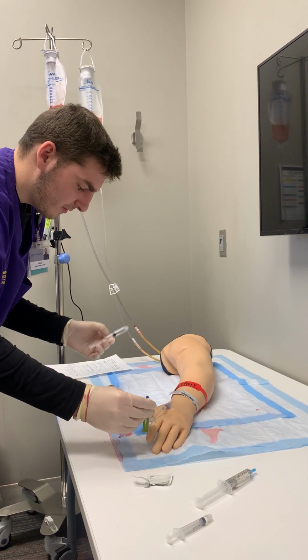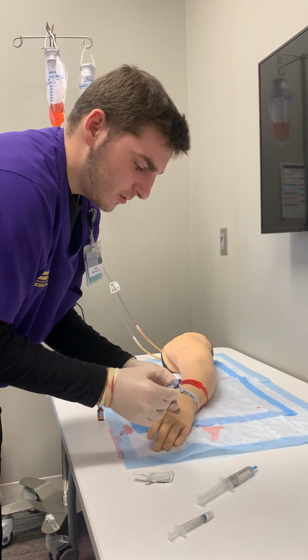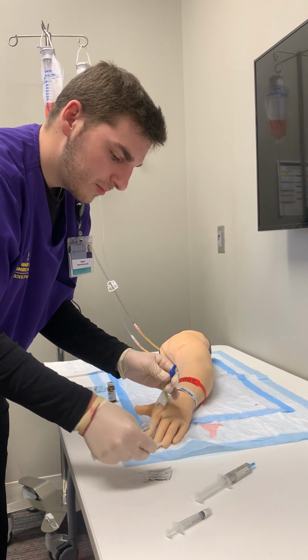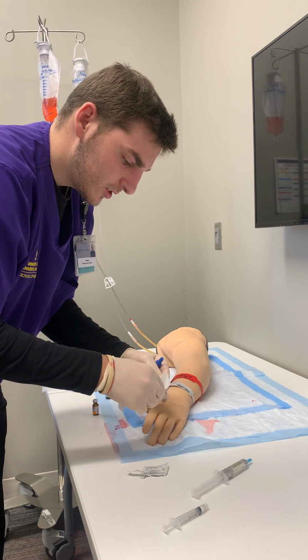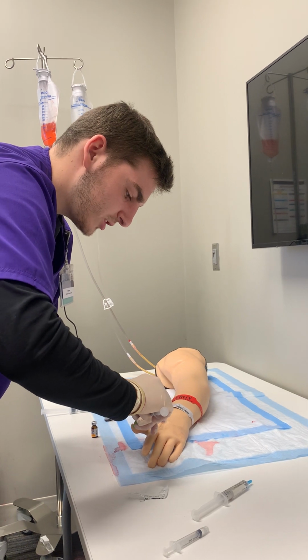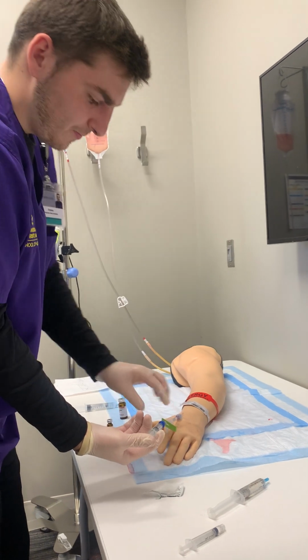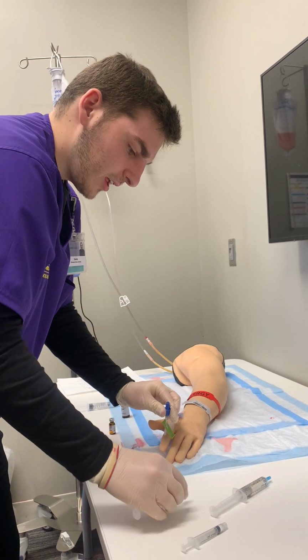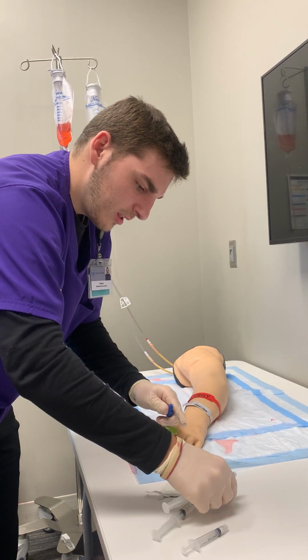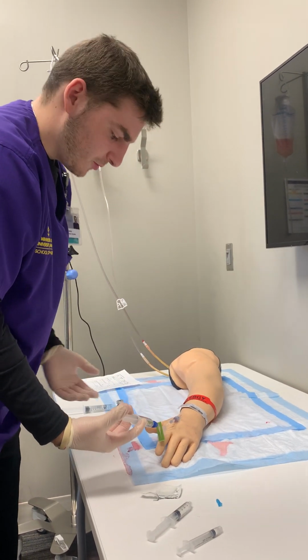And then I want to give you your furosemide next. So now I shouldn't have to re-scrub the hub because I know that this is sterile, but I'm going to do this one just in case, 15 to 30 seconds. And now I'm going to push this one over 2 minutes and verbalize that I'm pushing this over 2 minutes. Now I'll take this off again. And then lastly, I want to flush this at the same exact rate over 2 minutes. And I'm going to push this over 2 minutes.